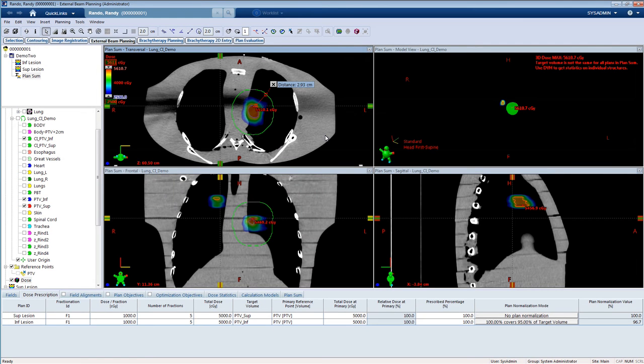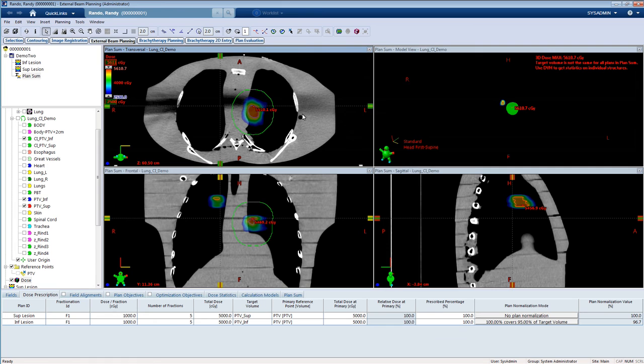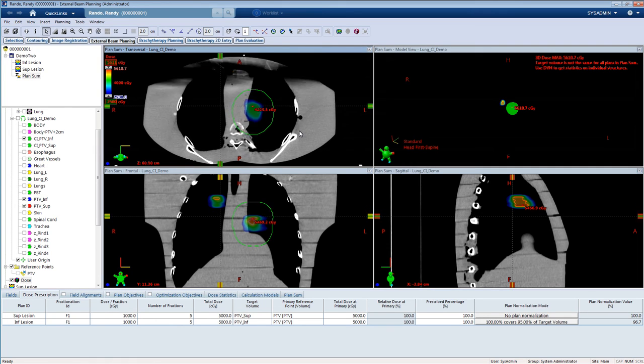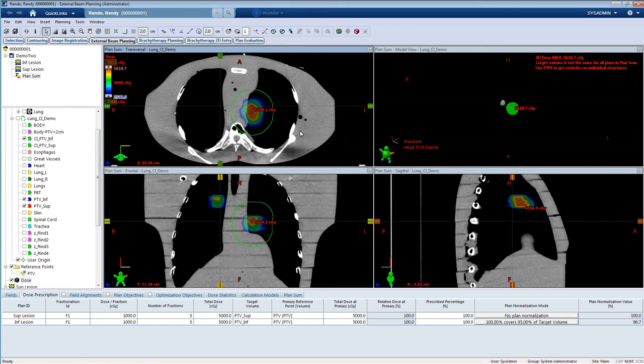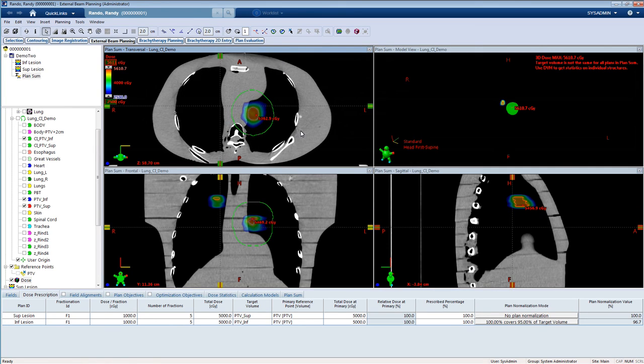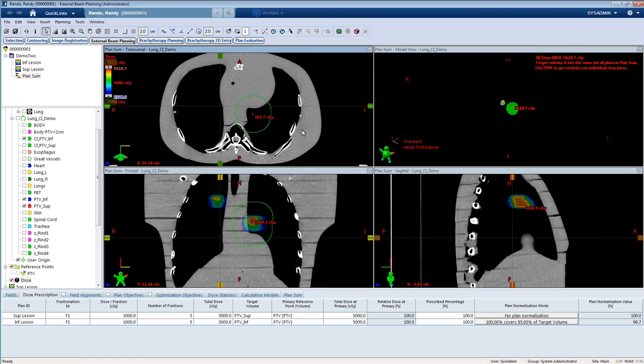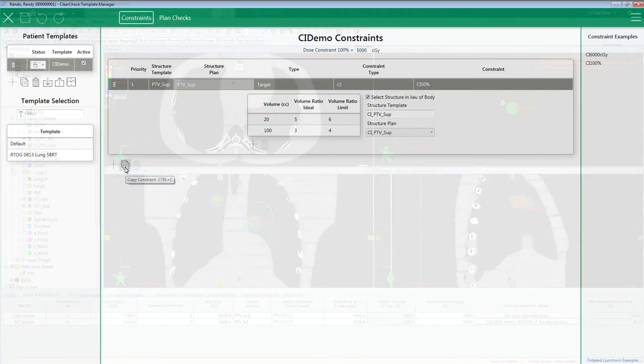Now I'm going to quickly evaluate the conformity index of PTV inf. Again, this is a 3cm margin around PTV inf. Now I'm going to visually make sure that no part of my 2500 centiGray isodose line is outside of this CI PTV inf structure. Perfect.